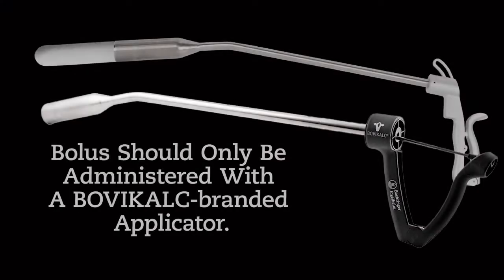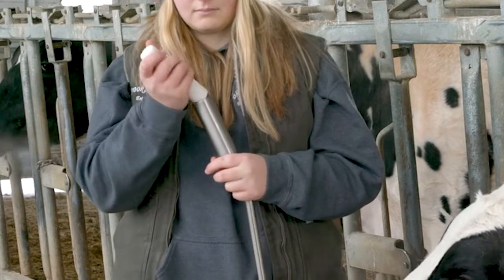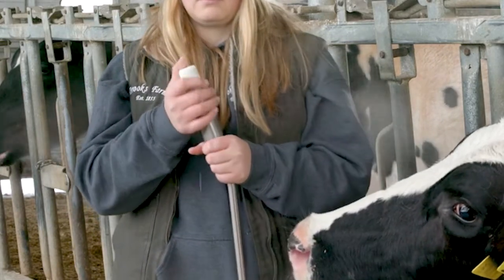Each bolus should only be used with a BovaCalc branded applicator. Place the bolus in the applicator with the rounded end pointing outward.